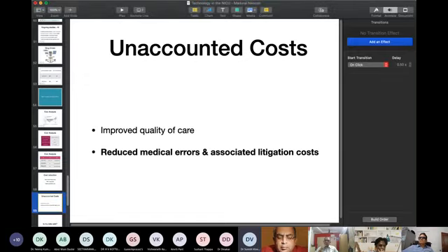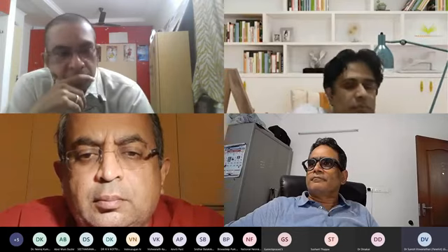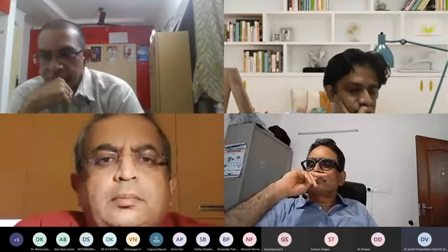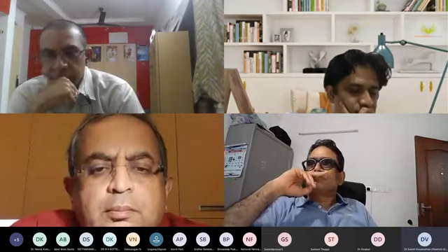Syringe pumps. Yes, some of the newer generation syringe pumps are coming that are much more compact. I know Mindray has a new N series that I've seen, which is probably half the size of the previous syringe pump. I'm not sure about the weight. The syringe and infusion pumps are really compact. But other than if you're using it for transport, is there really any advantage? Are you sacrificing anything and paying extra for a lighter weight syringe pump that you're not going to take advantage of? It's not like you're putting the syringe pump on top of the baby. It's going to be on a dock. And yes, for transport, moving it from one place to another, for the staff nurses it might be easier. But again, it comes down to a cost versus benefit analysis. That is my first answer to one of your questions.